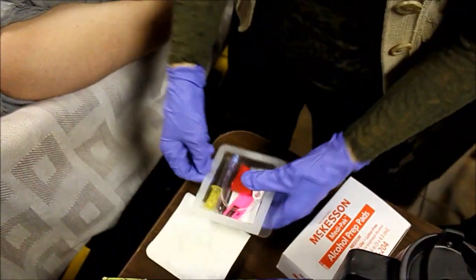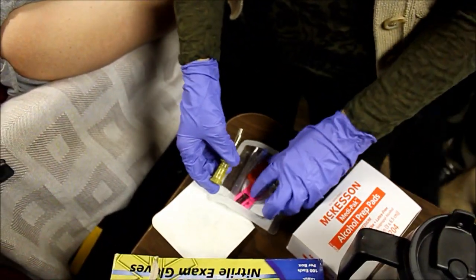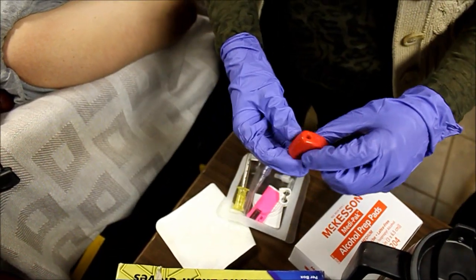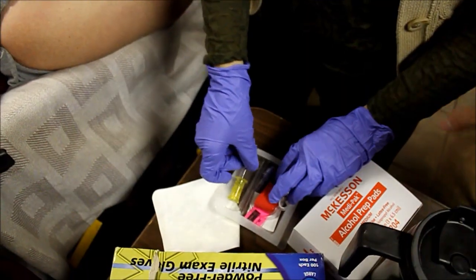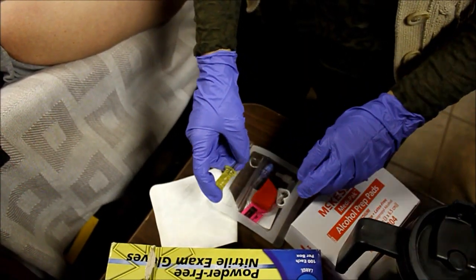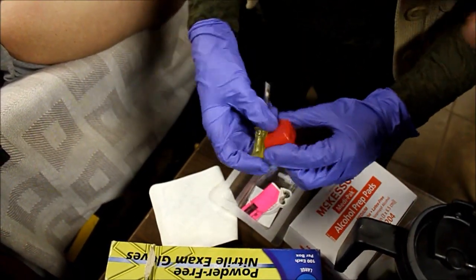You don't look at it at all. Don't worry, we're near a hospital. Oh, is that a sharps? That's just a sharps can — see when we're done, put the stylus in there. It'll be taking up to 30 minutes.